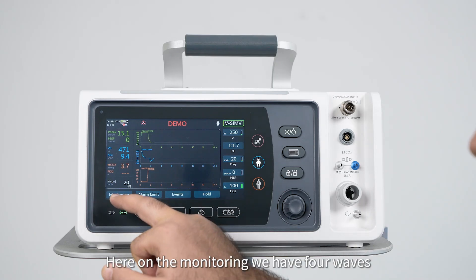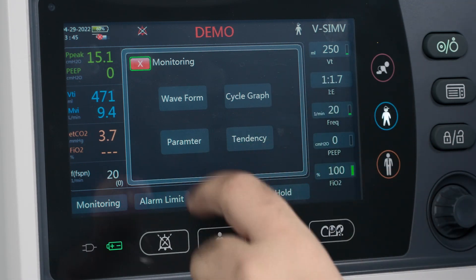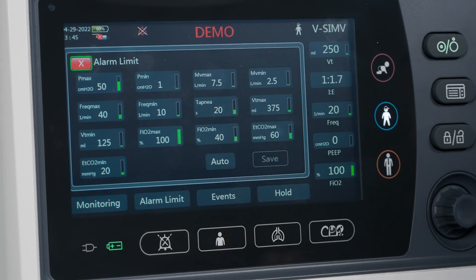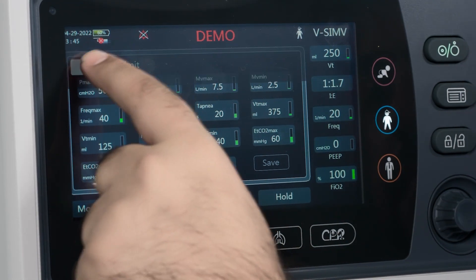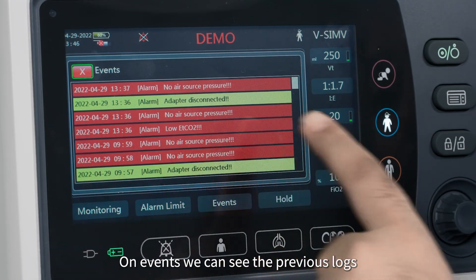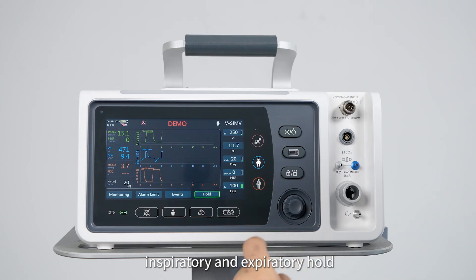In the monitoring section we have waveform, loops, parameter, and trends. On the alarm limit section, we can change the limits of the parameters according to the patient's needs. On events, we can see the previous logs. Under hold, there are two types: inspiratory hold and expiratory hold.